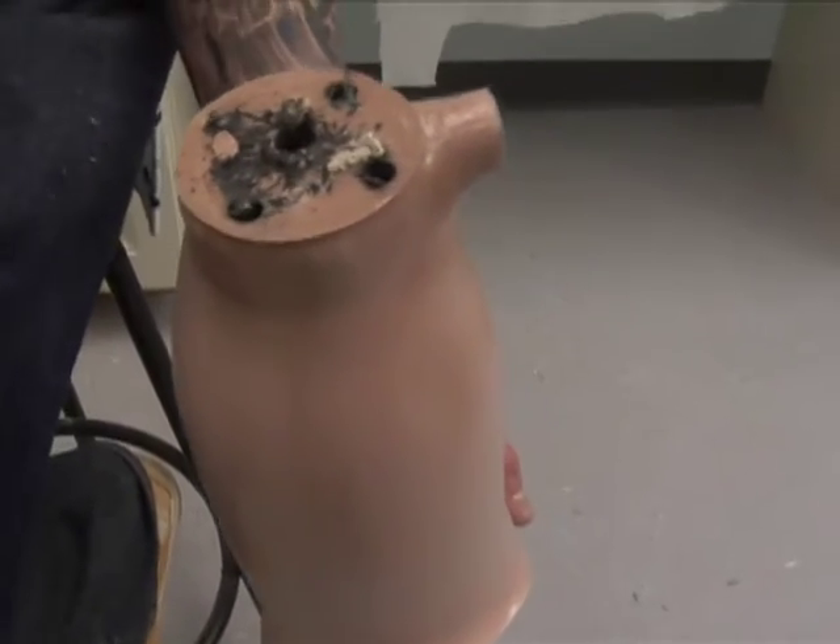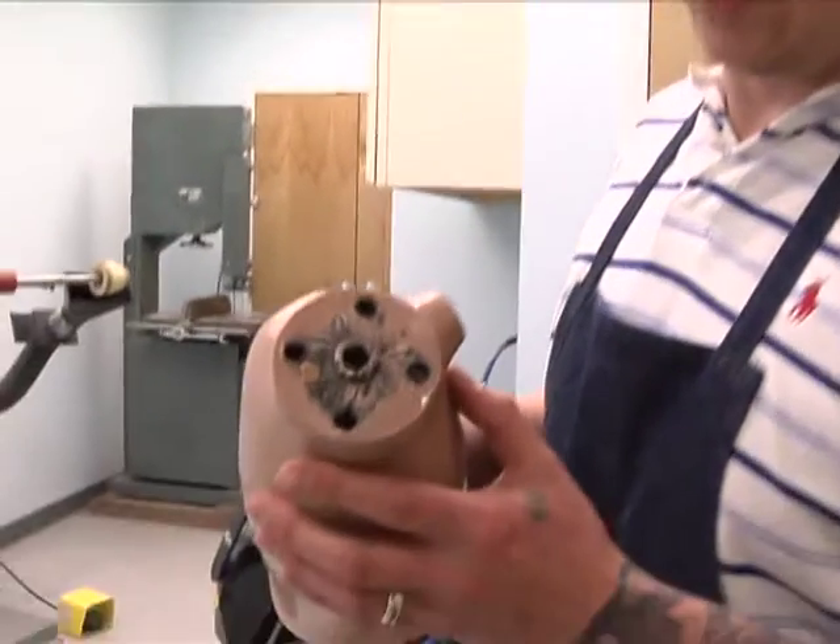Now we'll go back to our machine room and we'll flatten off the bottom surface. We'll have to flush off the bottom to ensure our pyramid sits flat.